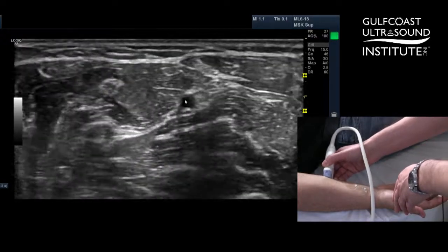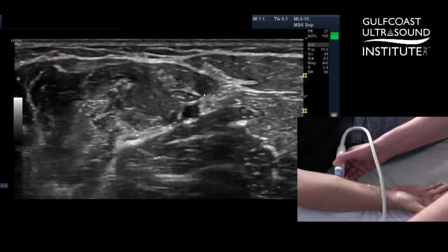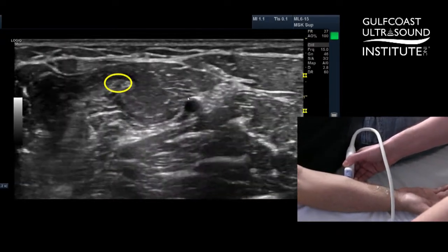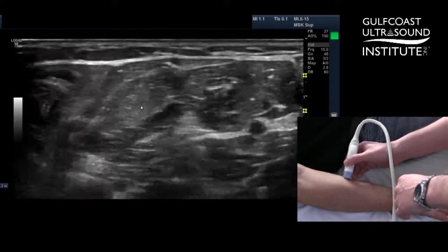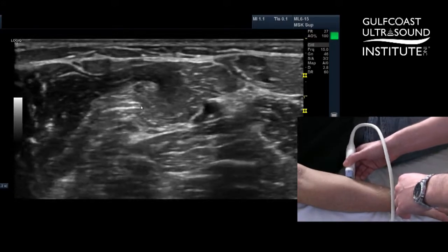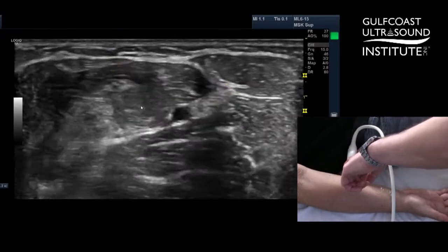Right about here, you can see the nerve fascicles as you get about two-thirds of the way up to the elbow. Then if you look medial from there, usually at about the same height, you can actually see the median nerve in the same place. So you can have your ulnar nerve and your median nerve both in view, and with one injection you can block both nerves.